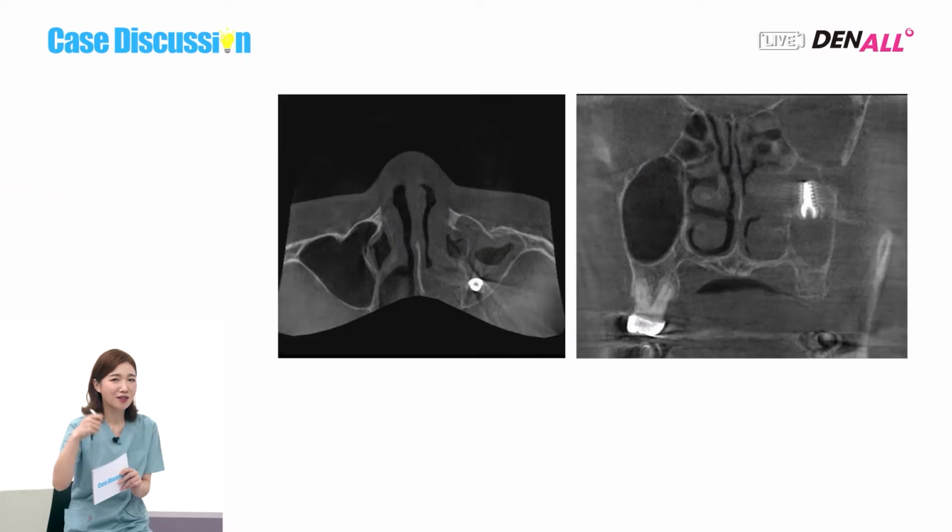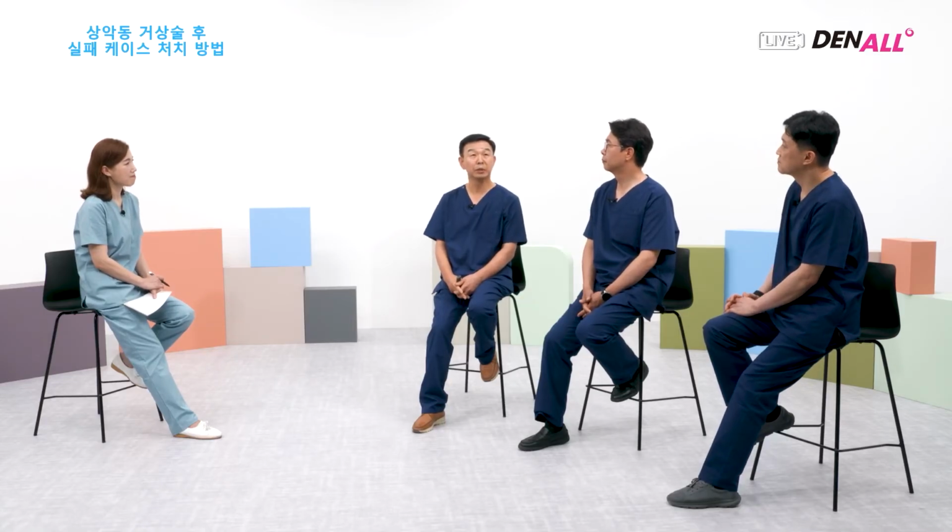In this case under discussion, when you open the window laterally, what instrument do you use? In general, after opening it laterally, I use the suction tip. Using negative pressure, it is removed. Therefore, the suction tip should be thick. Suction is switched off at the lateral window, and it is moved into the sinus, and it is turned on. After you rotate it, due to the negative pressure, the implant would be suctioned out.